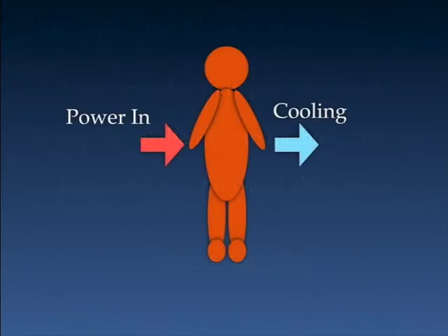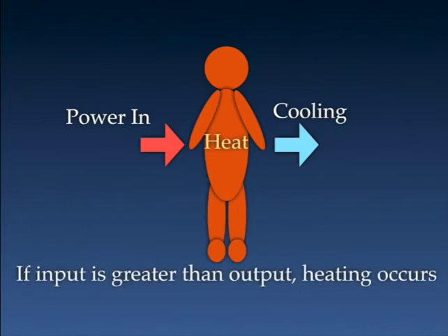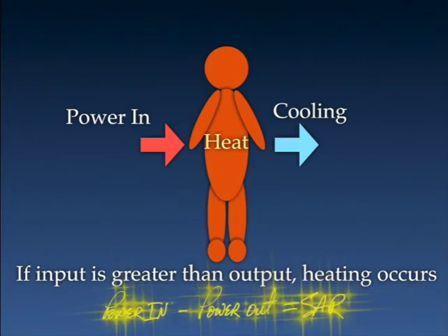So we're going to apply RF power into our patient. The patient is going to dissipate that energy by cooling. Quite simply, if the input is greater than the output, then heating occurs. One other way to look at it: power in minus power out is SAR.